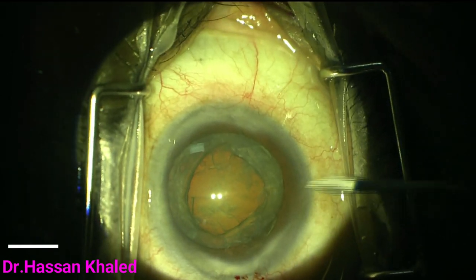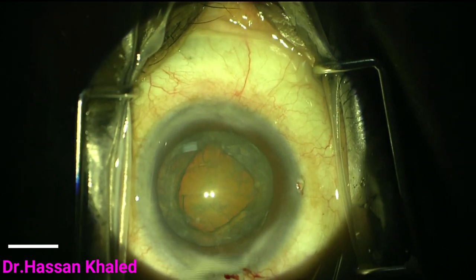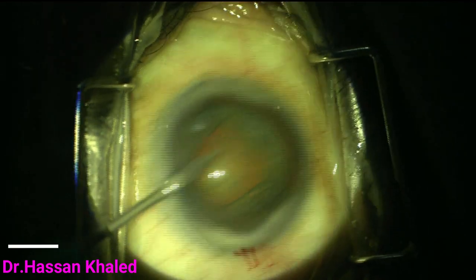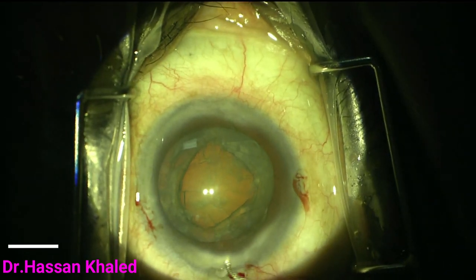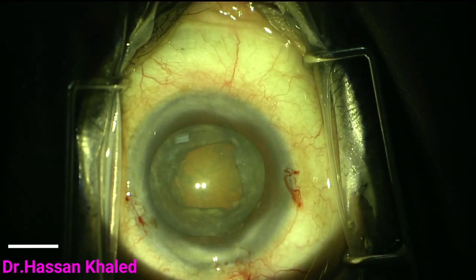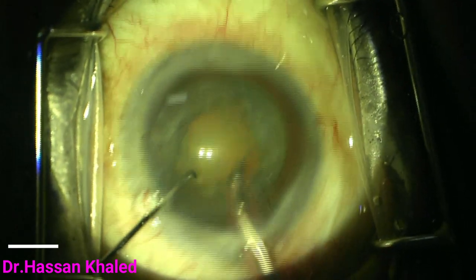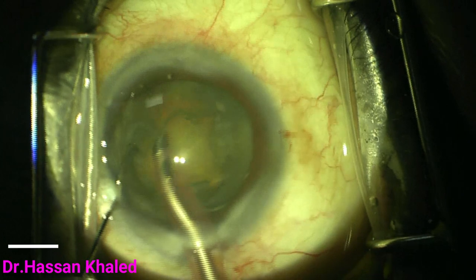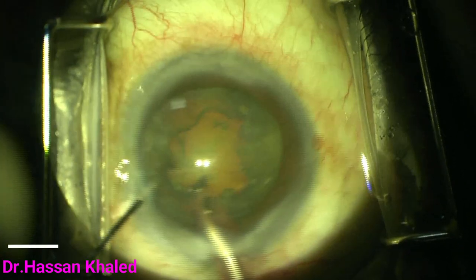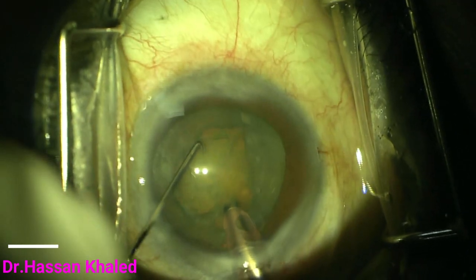Then I make two side ports using the MVR blade. Before starting, I will rotate the nucleus to be sure that I have a good and complete hydrodissection, as you can see now. The chopping is now started — I begin by applying vacuum to the cortex and anterior epinucleus.